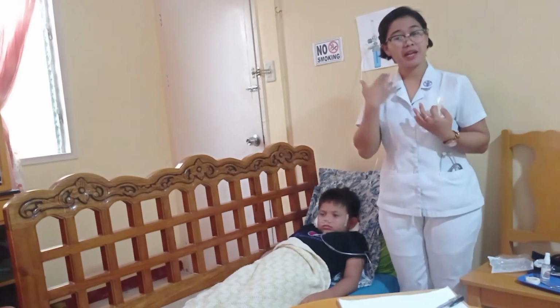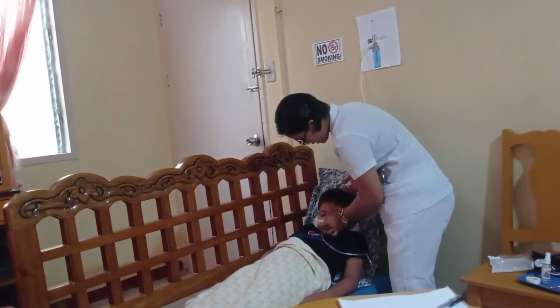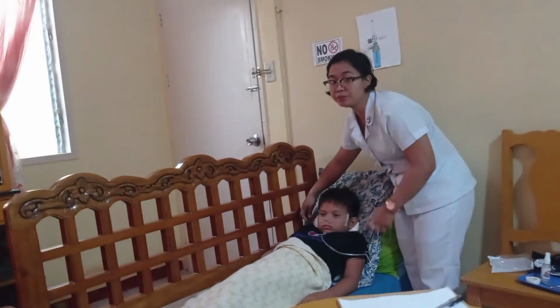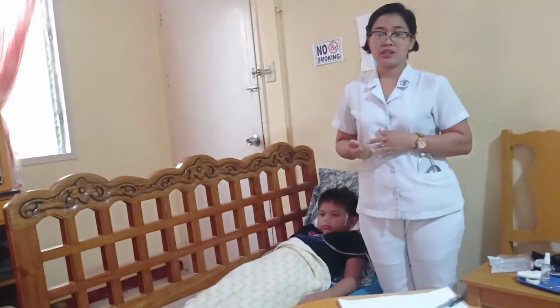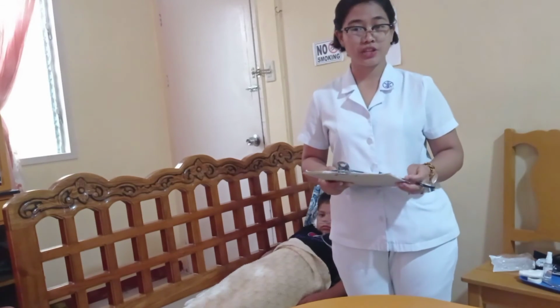If present, padding with a gauze pad may help relieve the discomfort. So I put some water-soluble lubricant. Then I am going to put some gauze pad to help relieve the discomfort of our patient's ears. The rationale for this is to ensure the comfort of the patient throughout the oxygen therapy.